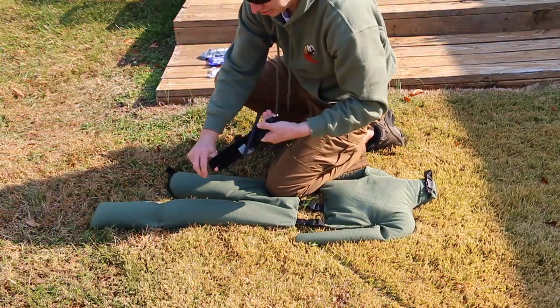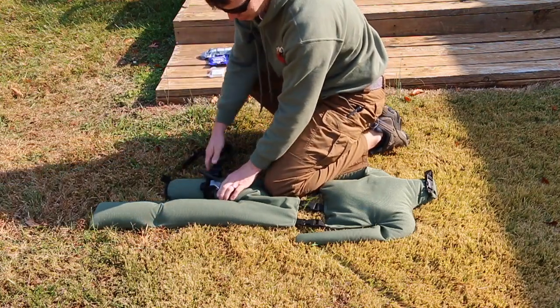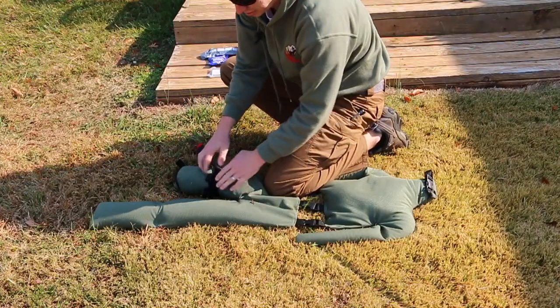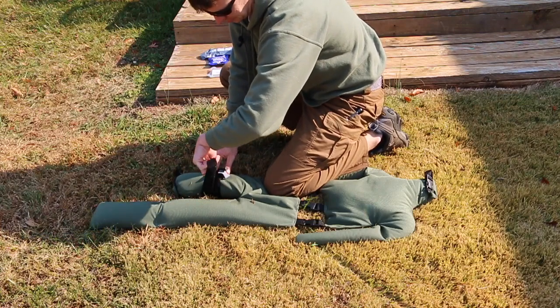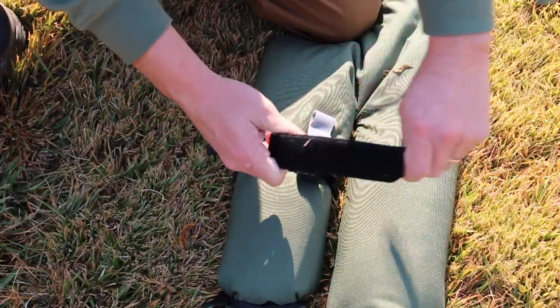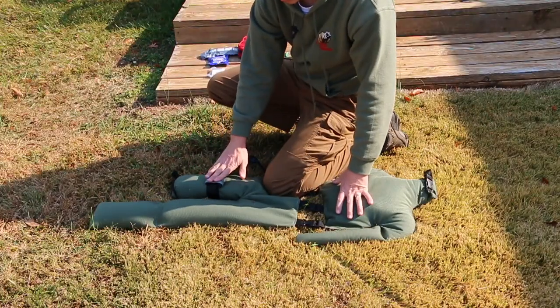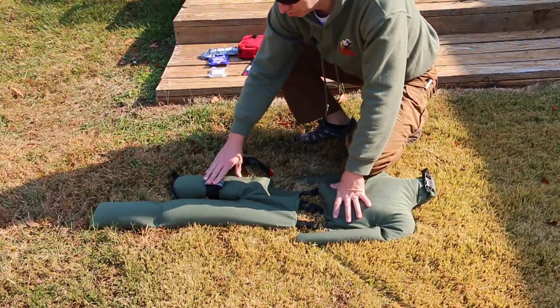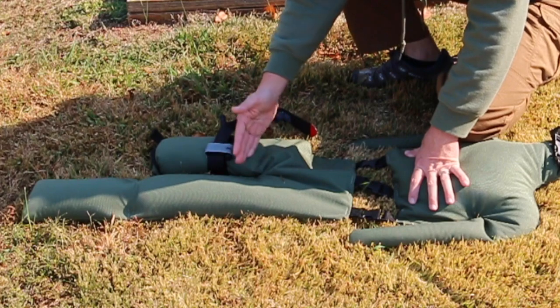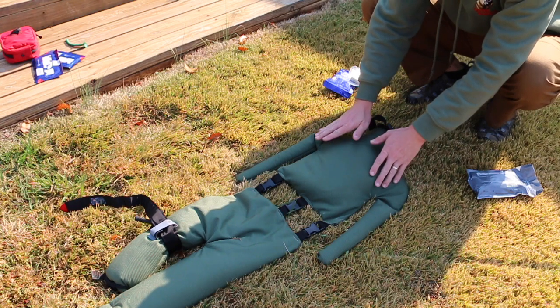So we're going to use the Gen 7 CAT tourniquet here. Put it on several inches above the wound. Pull this elastic band here tight, as if you're trying to cut off blood flow. And then we spin the windlass until bleeding is stopped. Now I usually tuck the tail in just to keep it nice and neat, pull the time stamp over and note the time. Now you should have bleeding controlled at this point. If for some reason you don't, you can apply a second tourniquet up higher, close to the torso. So the problem comes in when you're doing your exam.